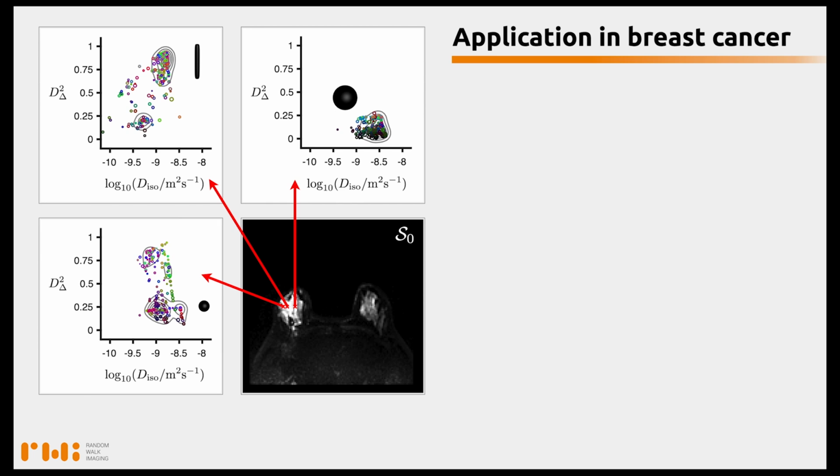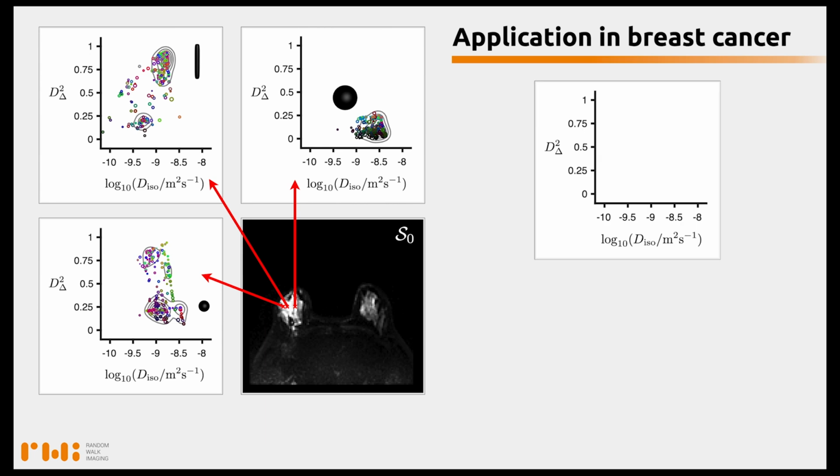While being comprehensive, this way of representing information is not practical. So we need to make sense of the distributions one way or another, at least a way that enables us to create maps out of them. A simple way to do so is to consider the space of diffusion tensors and to subdivide this space into different bins.